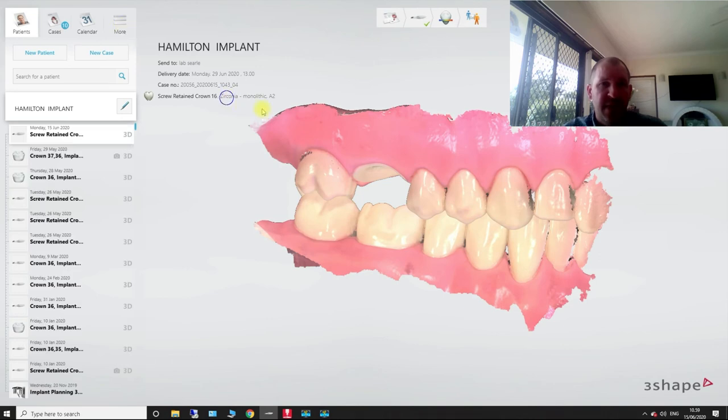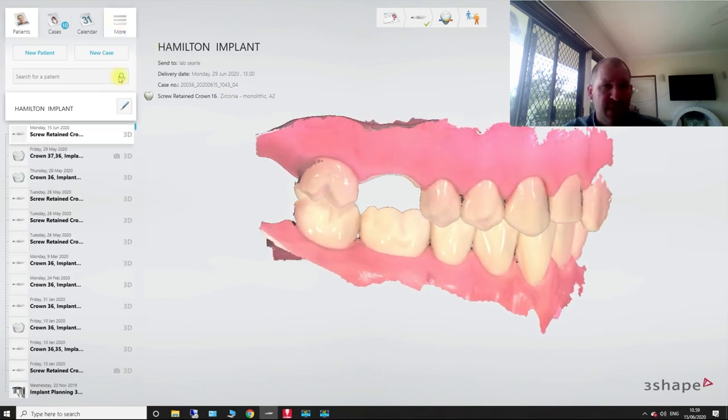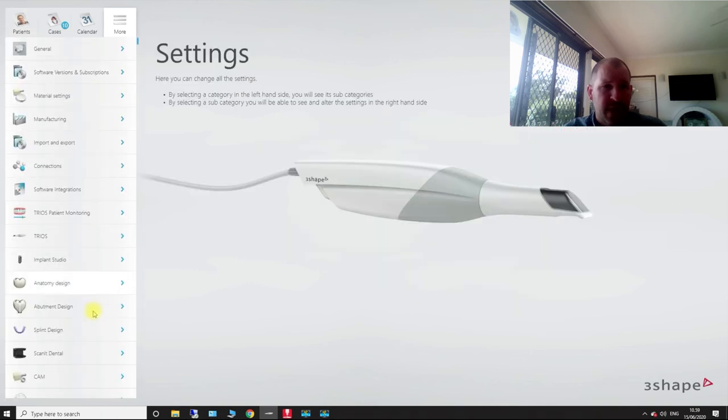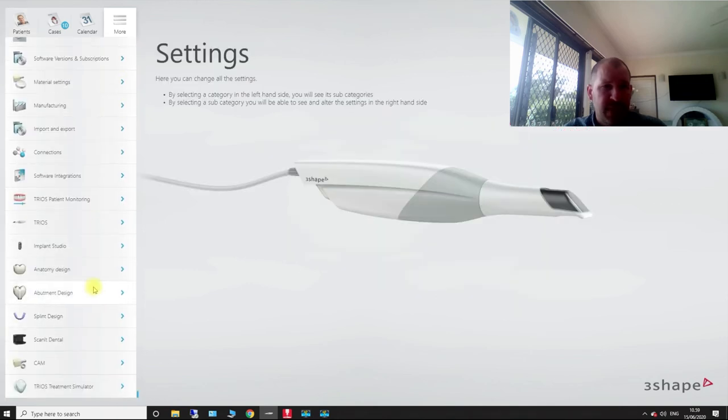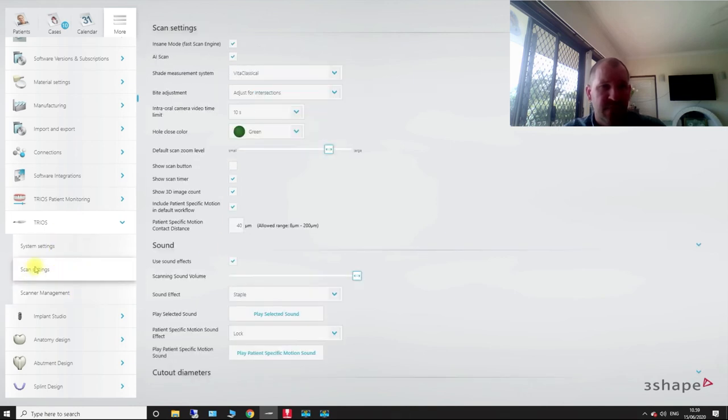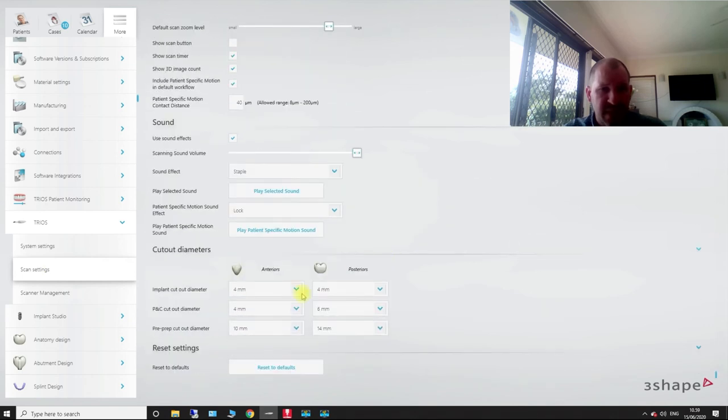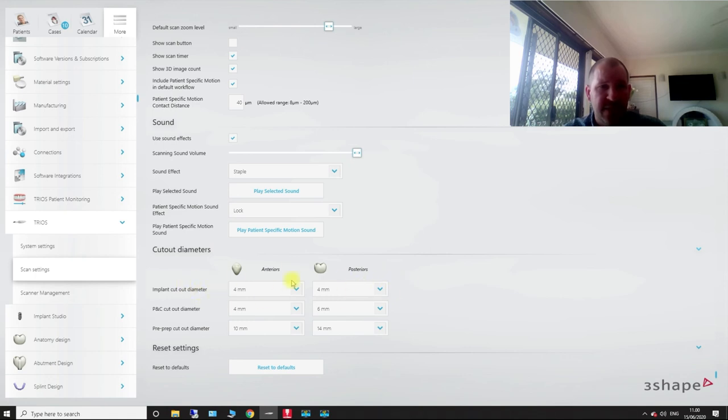So if I now, I would come into more, settings, and then if I come down to my Trios and scan and management, no, sorry, scan settings. So you can see down here, see how I've got my implant cutout diameter?